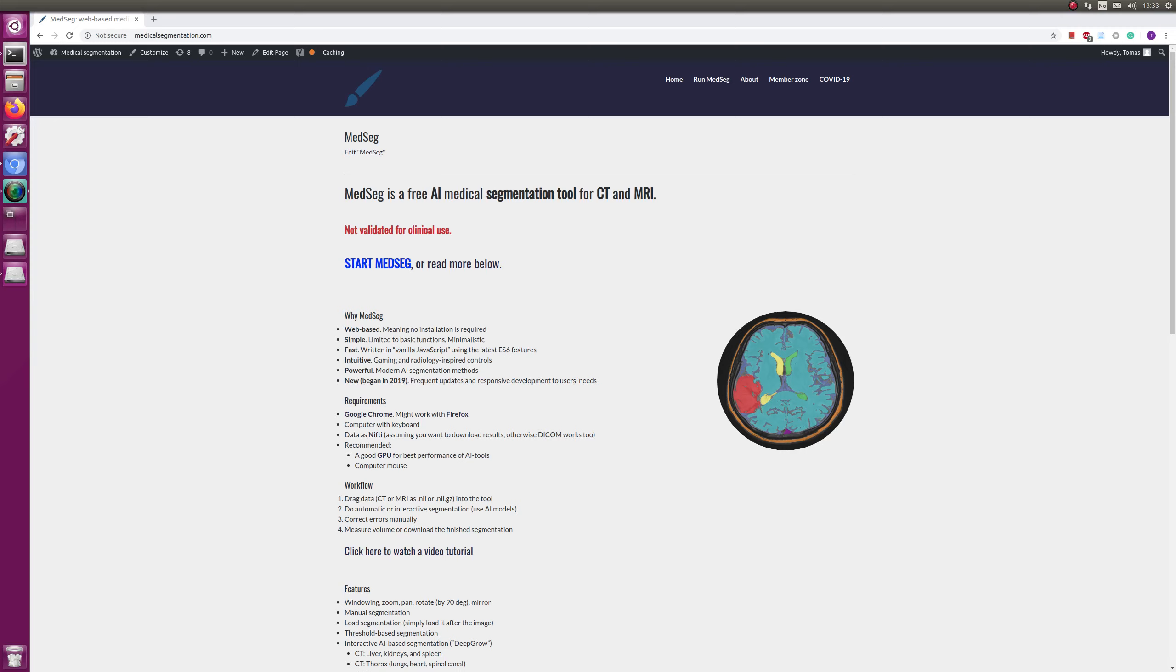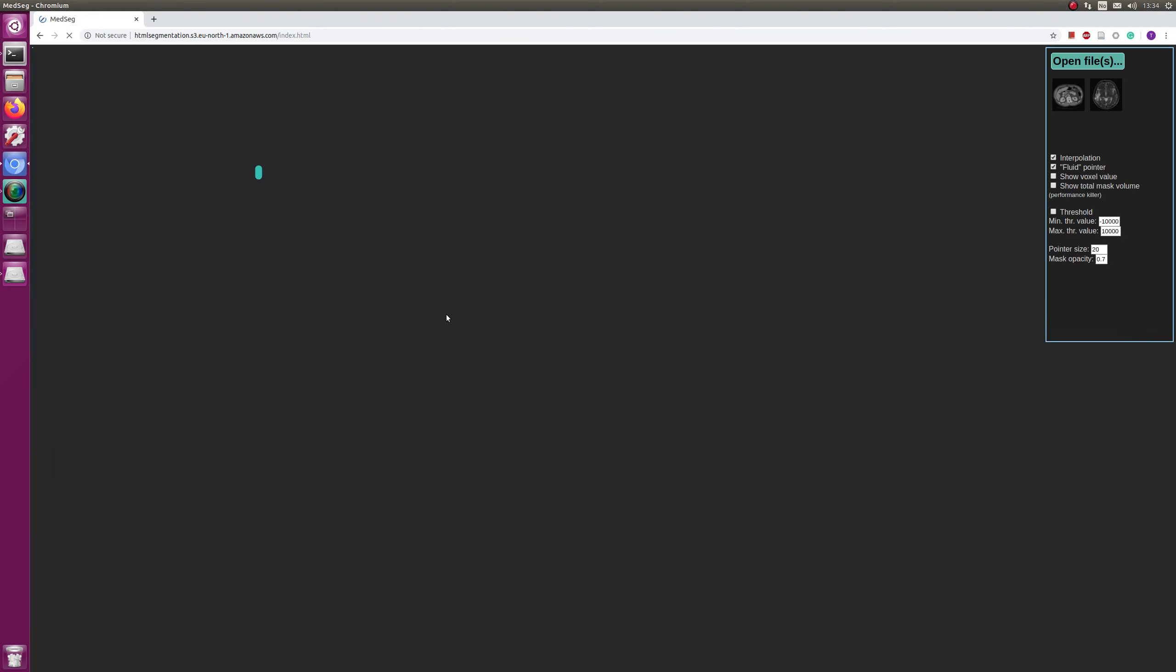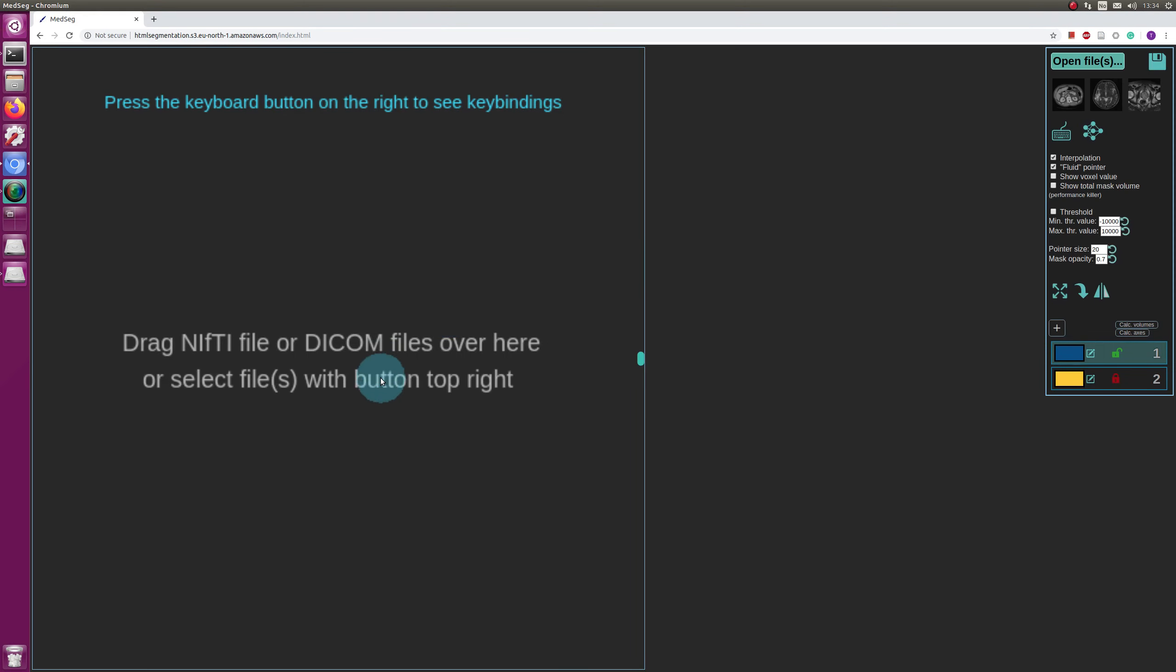Hello, this is Thomas. I am a radiologist working in Oslo, Norway, and in this video I will show you how to do lung segmentation using MedSeg. MedSeg is a tool that we're developing that runs in the browser and lets you do segmentations.